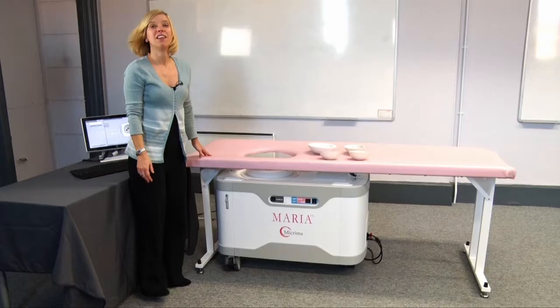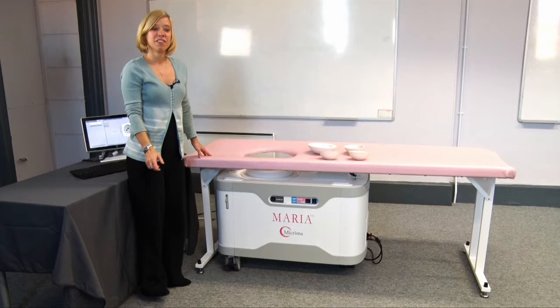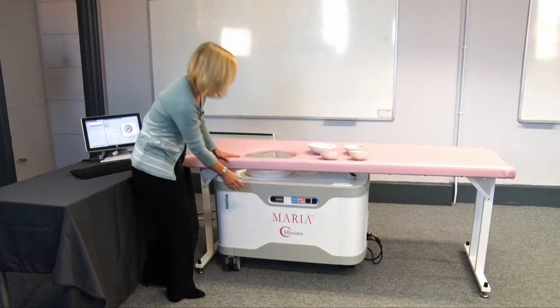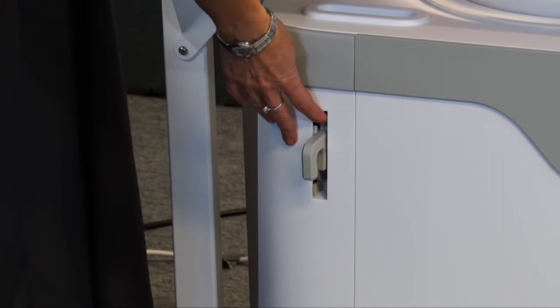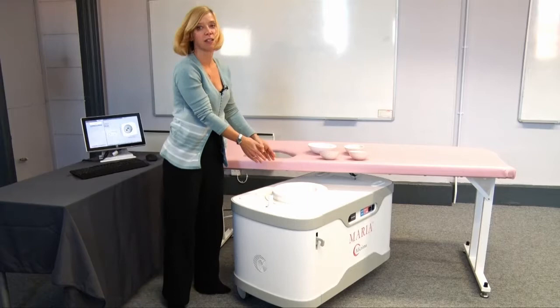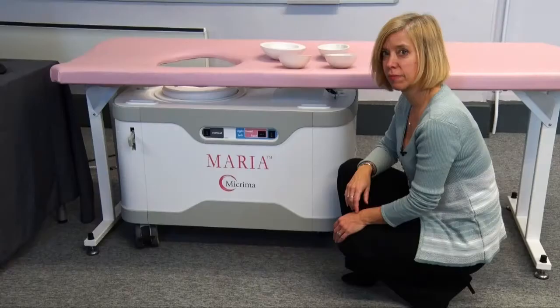This is the scanning and processing unit, fixed at this end to allow it to pivot. To pivot the system out, the array needs to be in its lowest position, and the handle comes up and out to allow you to pull out the system to get access to the array.